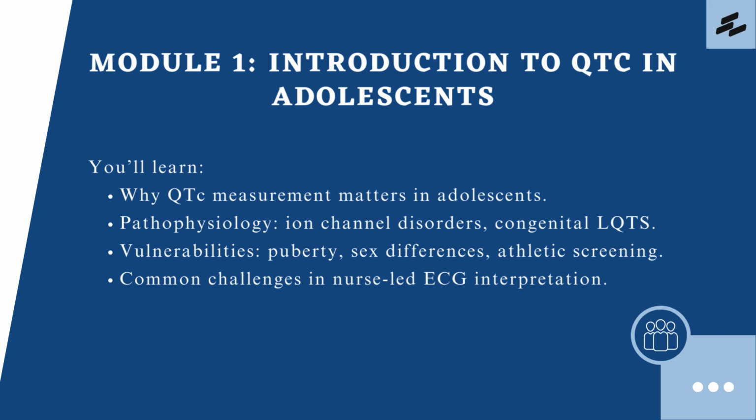Nurses in ED and ward settings may be the first to encounter prolonged QTc, but lack formal training in adolescent-specific interpretation. This module will also introduce the common challenges faced in nurse-led ECG interpretation, including difficulties with formula choice and uncertainty about thresholds for escalation.